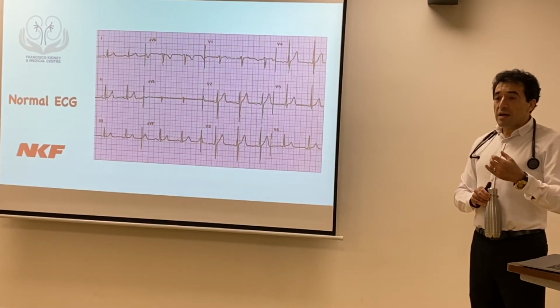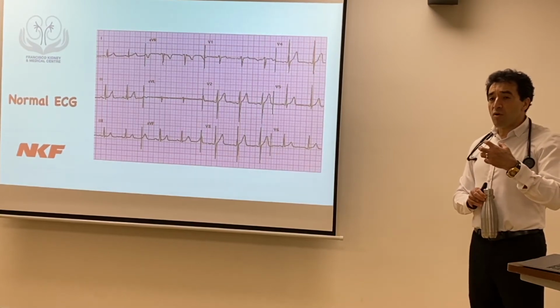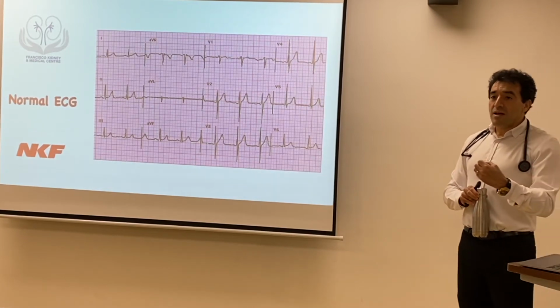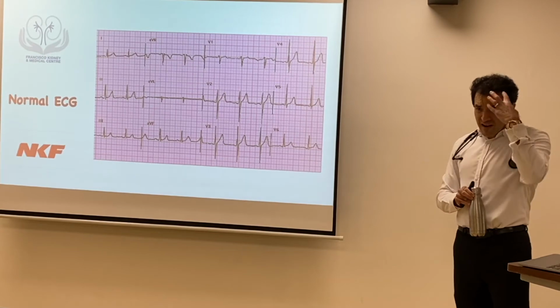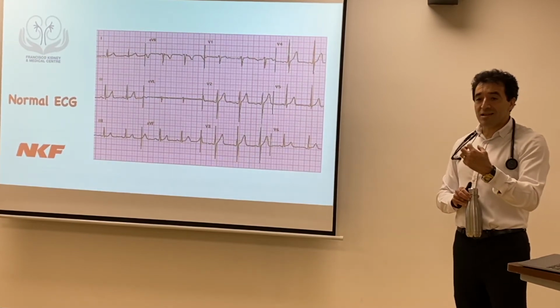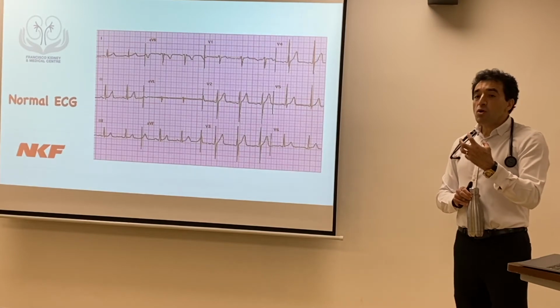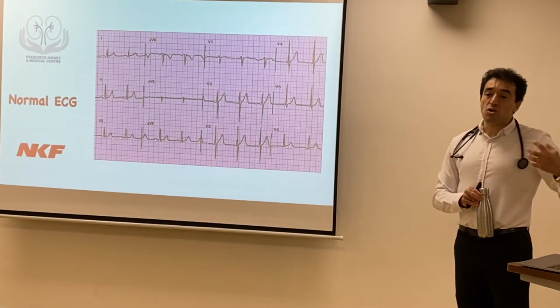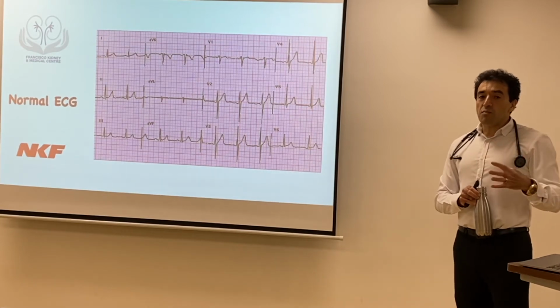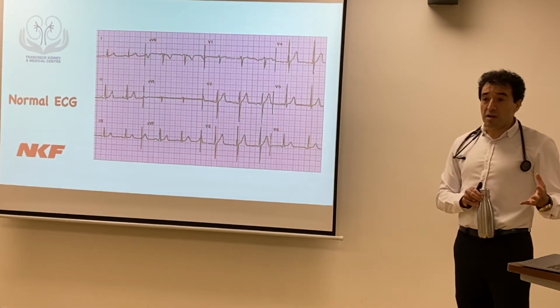So you can more or less know what the changes look like in, let's say, ventricular tachycardia or ventricular fibrillation. You familiarize yourself with that image, or certain arrhythmias, etc. But you need to compare it to what is normal. So it's part of recognition compared with what is normal. One of the most important things is that you actually know what is normal.